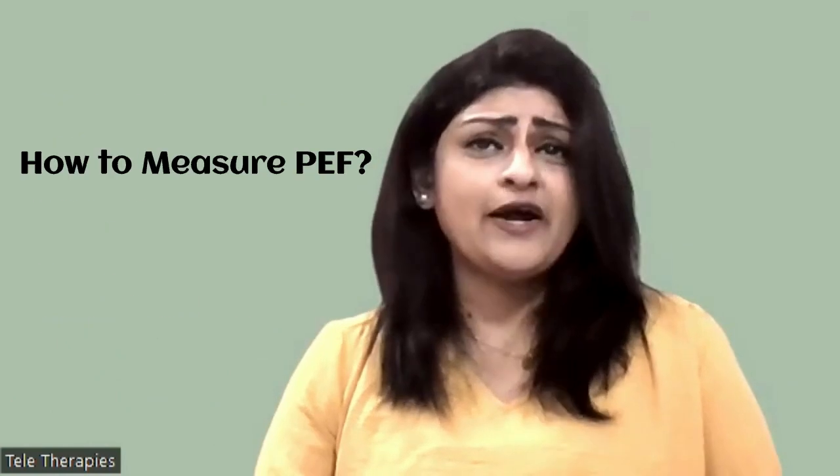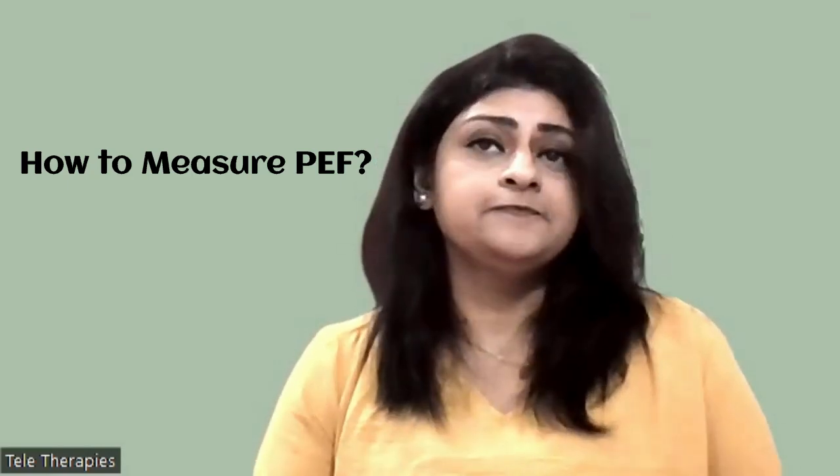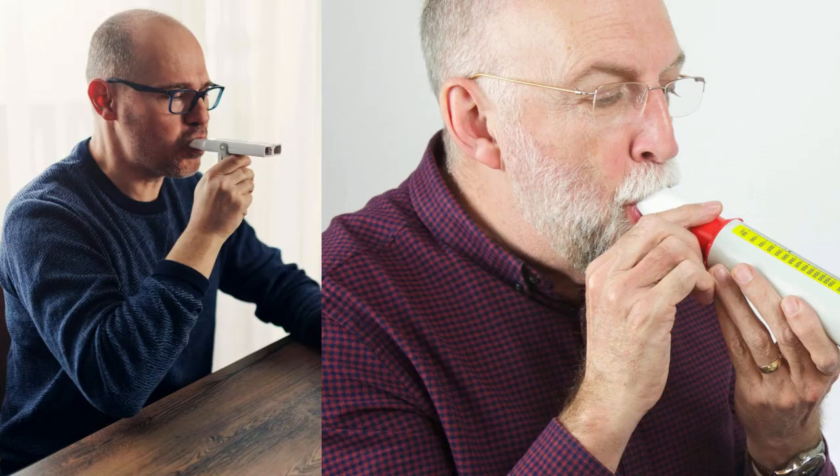Now let's get practical. How do you actually measure peak expiratory flow? It's simple. All you need is a device called a peak flow meter — a handheld gadget that measures your peak expiratory flow in liters per minute. Here's how you do it: take a comfortable position, either standing or sitting upright, and take a deep breath in.